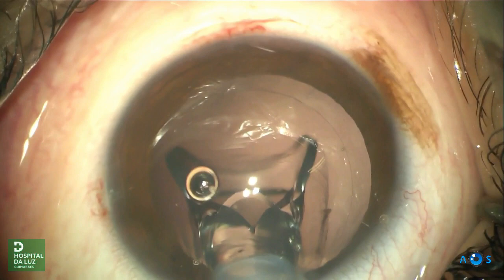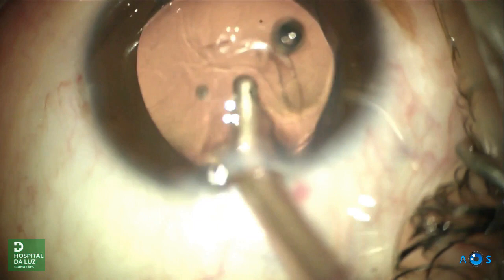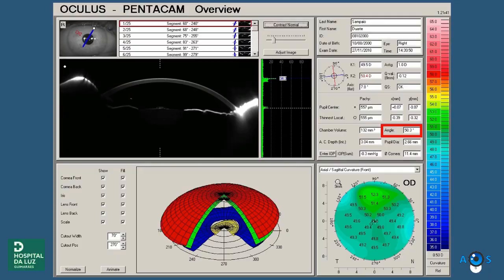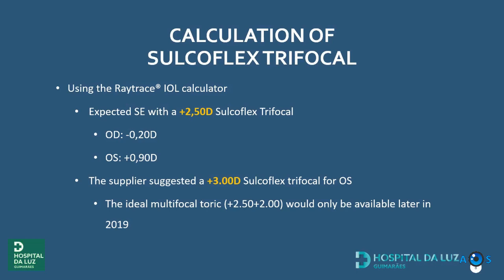A limbal relaxing incision was made in the steepest corneal meridian to reduce astigmatism. Implantation of the IOL occurred without problems. After surgery, the anterior chamber angle was increased in both eyes, making the implant of the secondary piggyback lens safe.